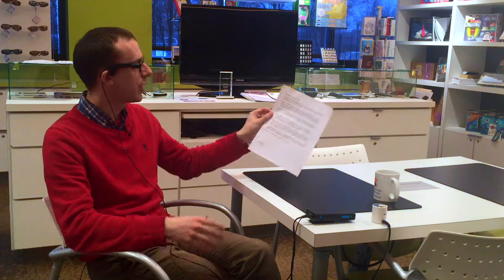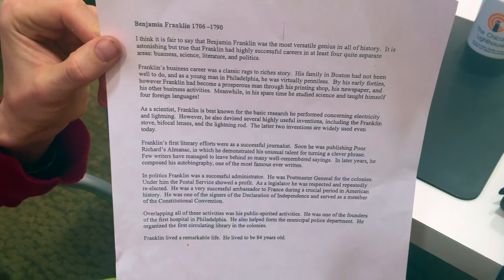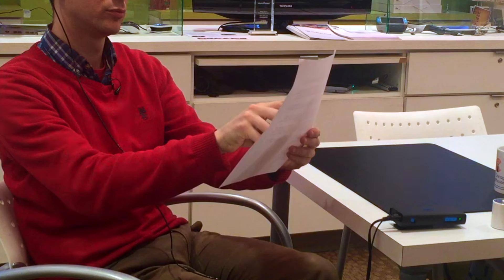There is one more advanced OCR method called touch reading, which allows navigation around a page without listening to the whole thing. Pointing at where you want to start, it begins reading, and moving your finger between paragraphs causes it to jump to those paragraphs. For example: "Franklin's business career was a classic rags-to-riches story... As a scientist, Franklin is best known for his research on electricity and lightning... Franklin's first literary efforts were as a successful journalist." Extremely intuitive navigation.